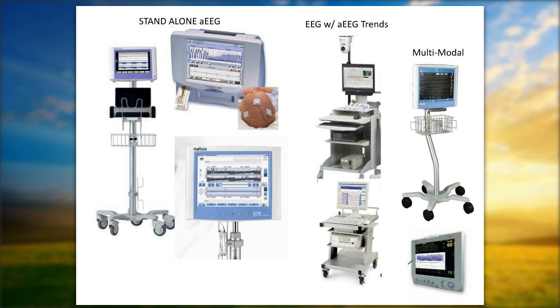On the market right now, there are basically three kinds of devices. So you have your standalone aEEG device. This is just going to be a device whose only purpose is to do aEEG. These may or may not connect to your hospital's network. These may or may not have printers. They may or may not have video. Typically, they do not. And they typically don't interface very well with your hospital server for being able to keep your files archived long term. So although these are great standalone, easy to use devices, they have some limitations as well.